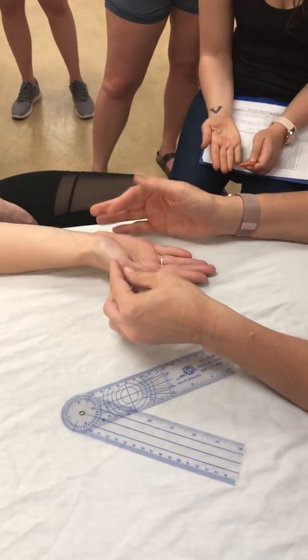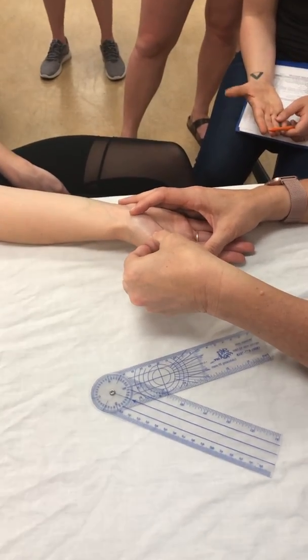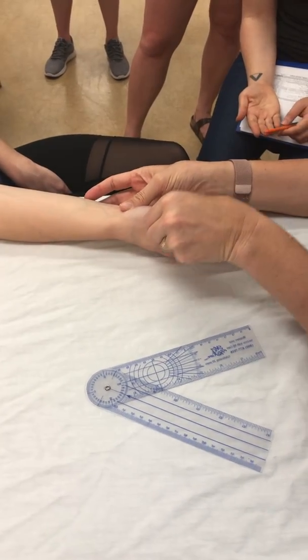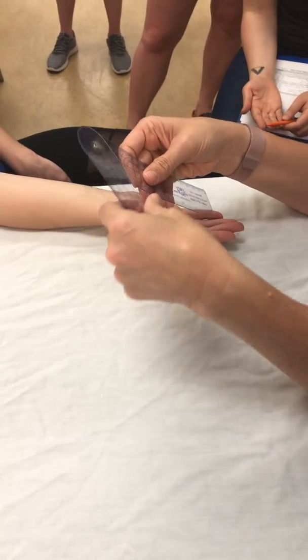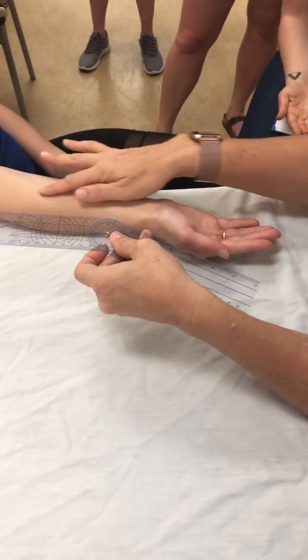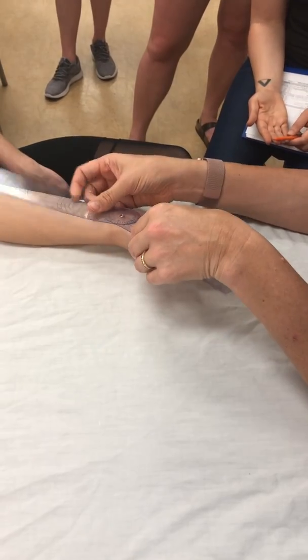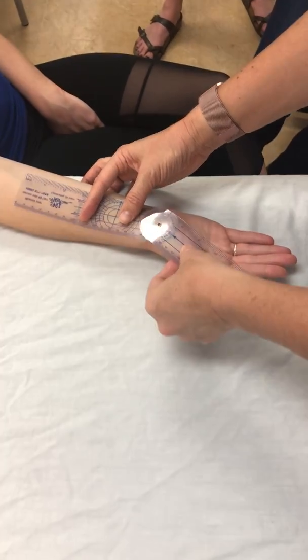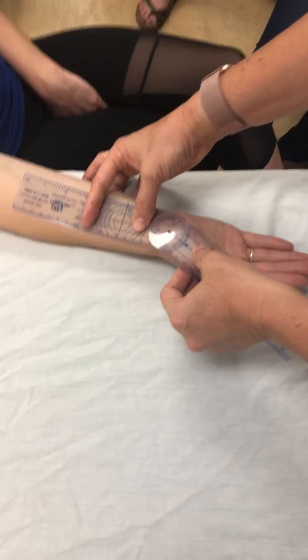Okay, so now we're measuring the position of the metacarpal relative to the radius, because this is going to be flexion and this is going to be extension. So this is where we're going to align the stationary arm now along the radius. And we're going to get that 0 spot. We need special filming goniometers, I tell you. They're super glary. Lots of glare.